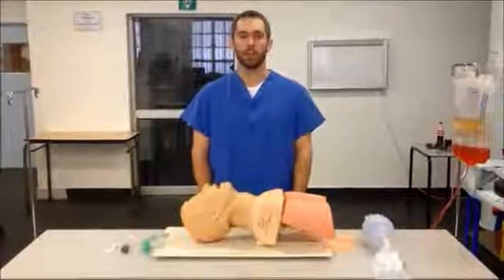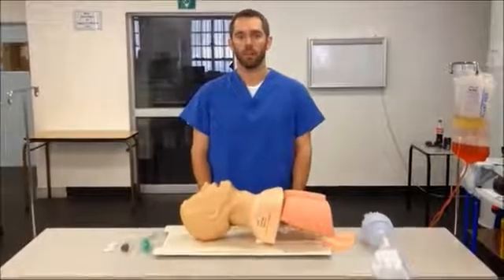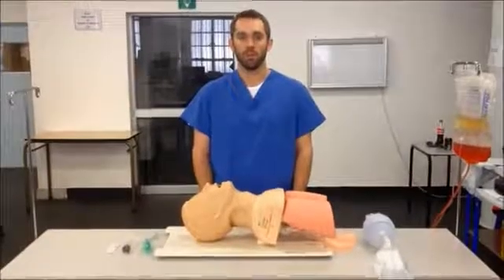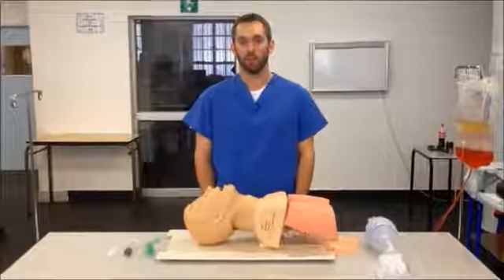Today talking about correct insertion and use of a laryngeal mask airway, or LMA. An LMA is a supraglottic airway that can be used for the non-definitive management of the airway or as part of a difficult airway management algorithm.